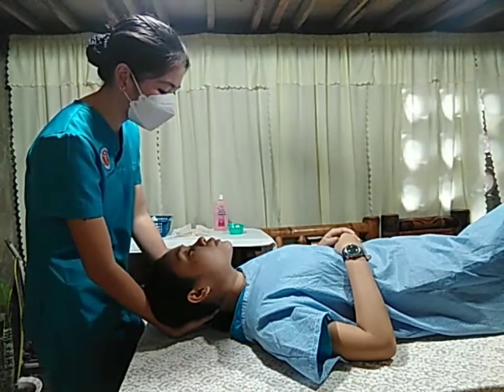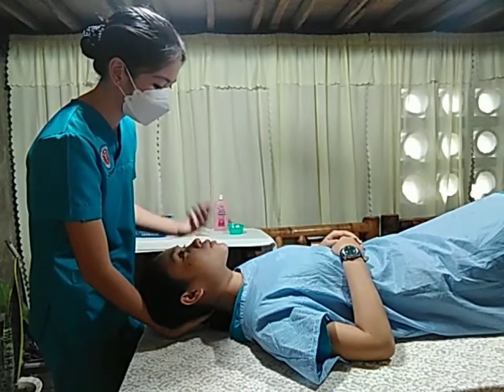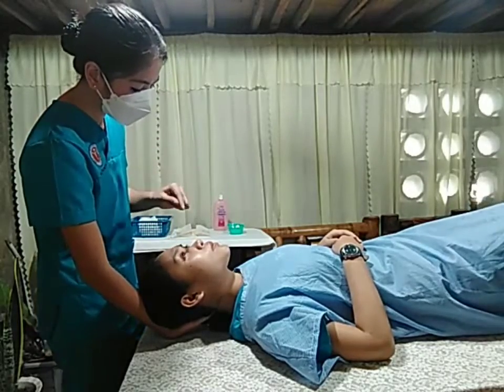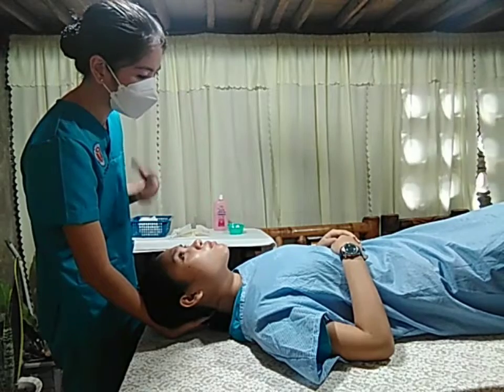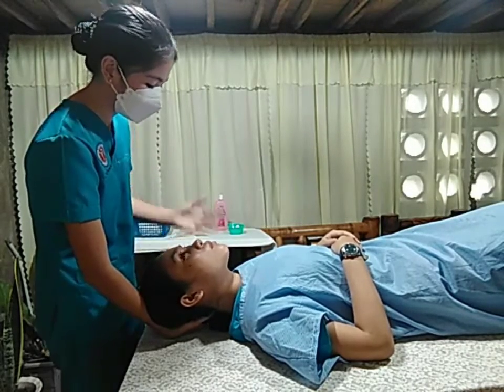So, ma'am, alayon ko ang ginhawa. Okay, ma'am, alayon ko ginhawa gamit ang imong baba, ma'am. Kay since magbutang man ko sa imong nose, ma'am, og drops, pwede ang possibility nga matukan ka or something ana, ma'am. So, alayon na ko, ma'am.